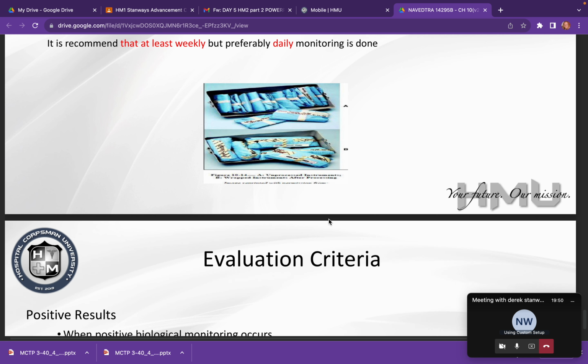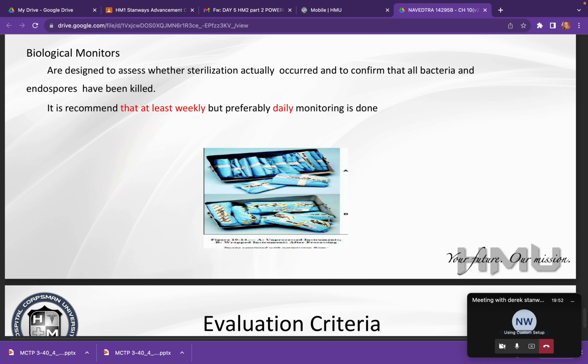If you can see this picture up here, that's tape, and all those black markings are the external indicators showing that the parameters have been met. Everything's been hot enough, bless you. And so it's good to go as far as the outside, but once we open it, we should still see that little indicator with the black strip showing that it is fully sterilized.